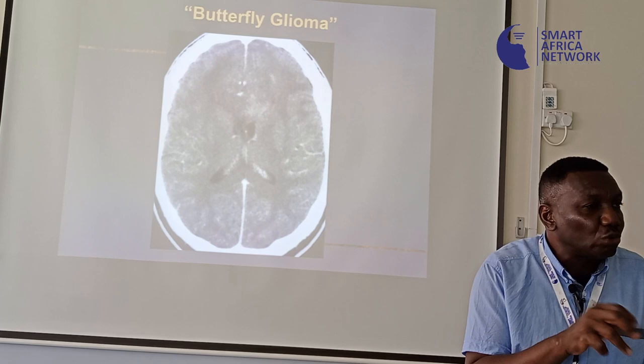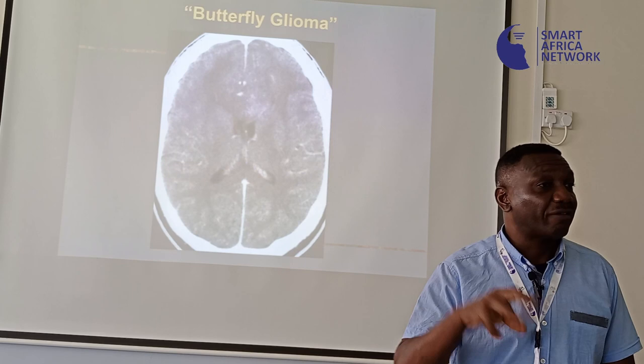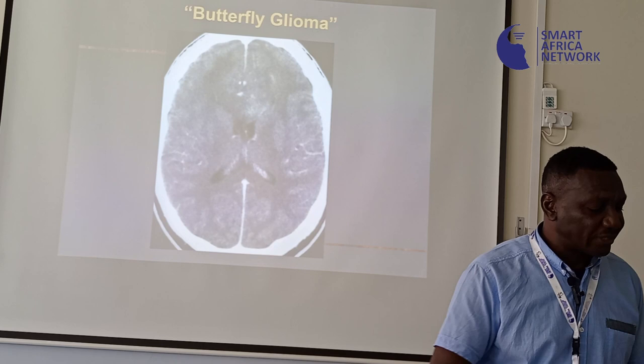So when you're not sure, and want to look at the bony anatomy of a particular lesion, you do a CT. Because sometimes we have calcifications within tumors, and it's difficult to see whether these are calcifications or hemorrhages, because all those things appear the same color, dark on MRI. So sometimes we need to do CT to corroborate our suspicion of lesions.